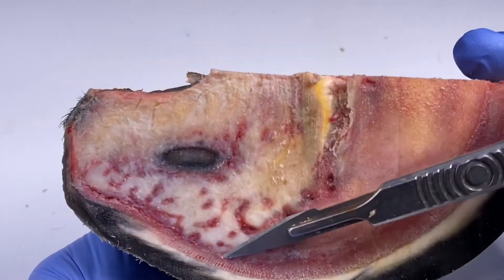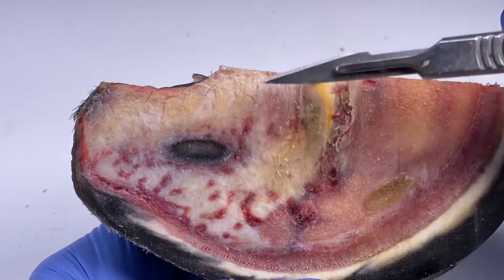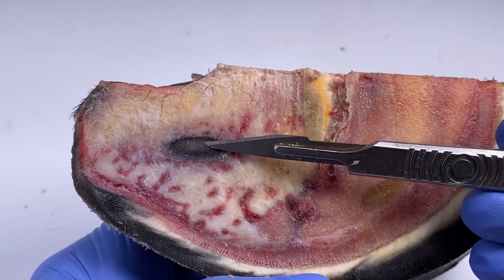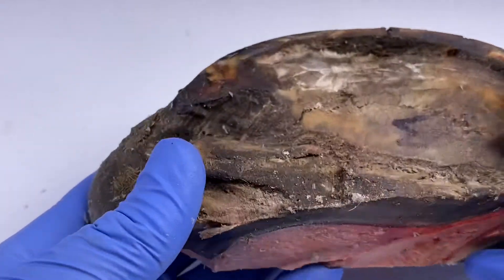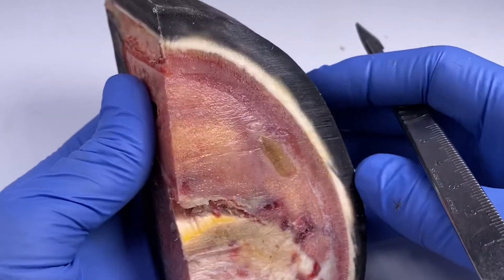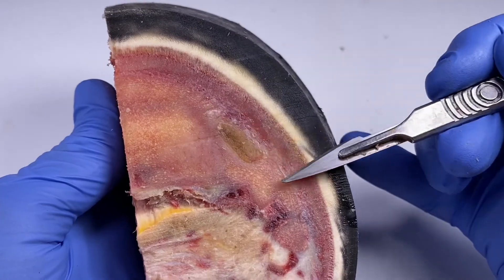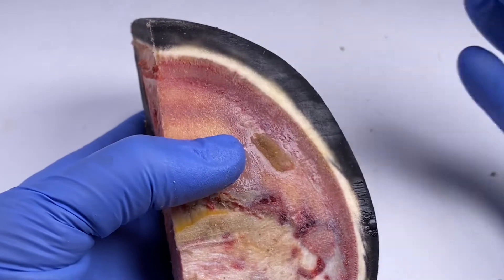It was pretty amazing just how big this was. This part here is the collateral groove of the frog, and so we're almost at the very edge of the collateral groove, the very end of it. The next thing about this is the area where the sensitive lamellae — which comes off the coffin bone — are going to interdigitate with the insensitive lamellae which are coming off the hoof wall.